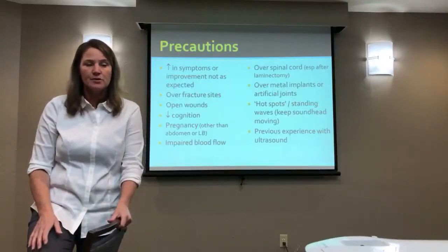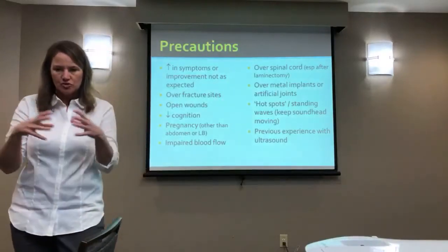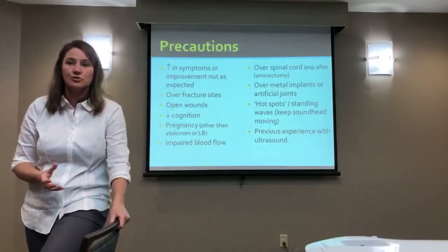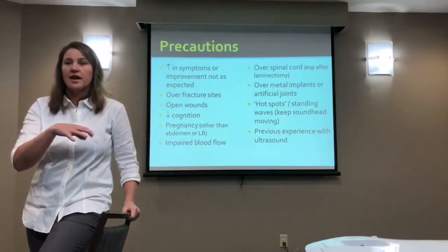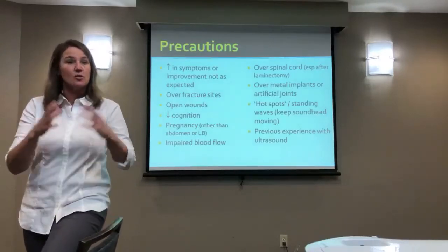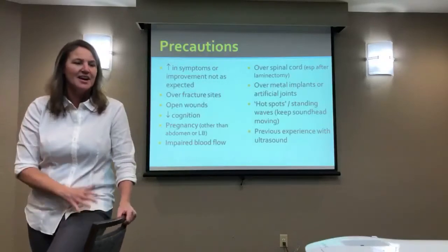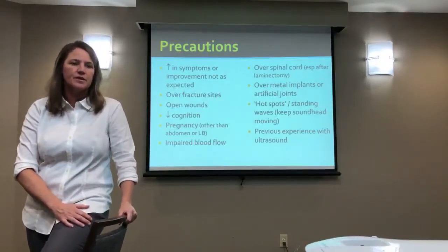Pregnancy, other than the abdomen or low back, I could lump that in with so many diagnoses where you have a certain condition that is a temporary condition, or that could have all these side effects that could make your treatment more concerning, then you've got to consider that. So I don't treat pregnant women. I'm not a female specialist, so there are things going on in their body that I may not fully understand, but certainly joint laxity is one that I'm familiar with because I have been pregnant. I've had kids. So knowing what you're doing and why you're doing it during those conditions.